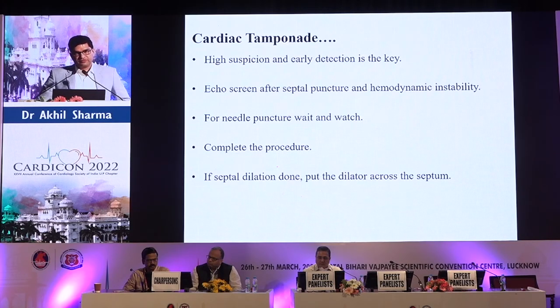Cardiac tamponade is definitely real, and it may happen at any time. So always have high suspicion whenever you do the puncture, and with any hypotension or hemodynamic instability, go for echocardiography. If it was only a simple needle puncture, wait and watch, and if there is no tamponade, go on and complete your procedure. If septal dilation was done and then the patient develops tamponade, please put your dilator across the septum. Manage the patient by pericardiocentesis, and if not improving, shift the patient to the surgical OT with the dilator in place.